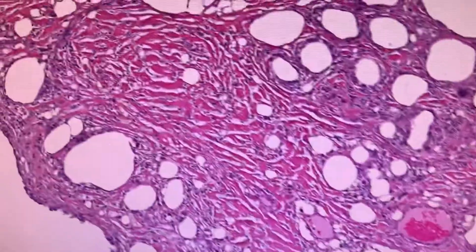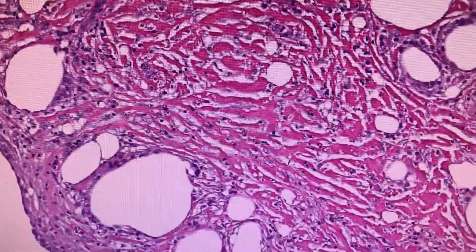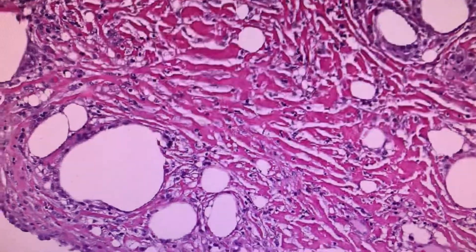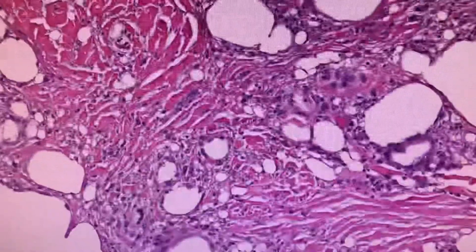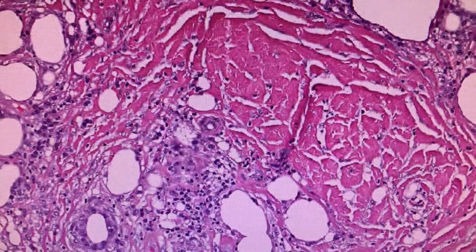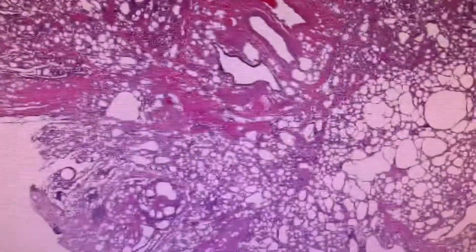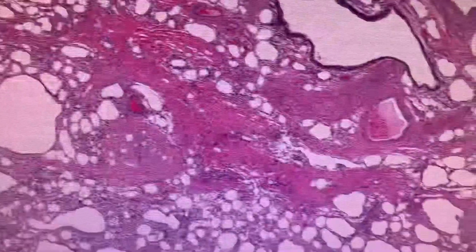It is caused by aspiration of oily or lipoid substances, such as mineral oil, most commonly taken for constipation. This is a beautiful example of a case in which the asteroid body shown in the first slide is clearly not caused by sarcoidosis — this is caused by exogenous lipoid pneumonia.